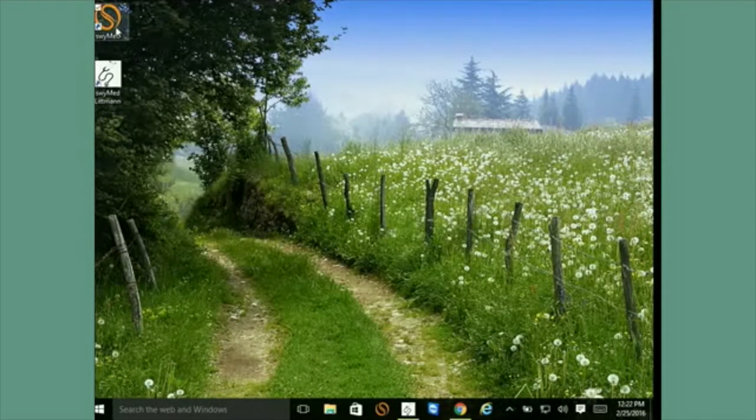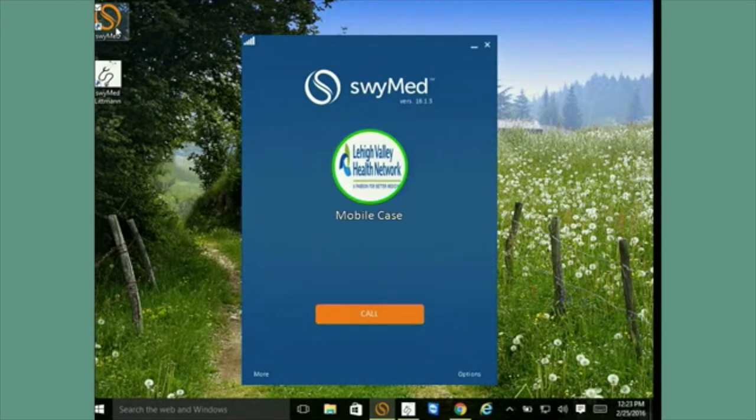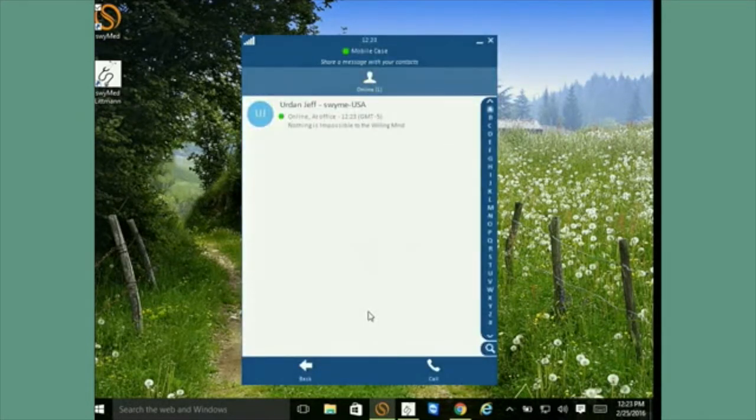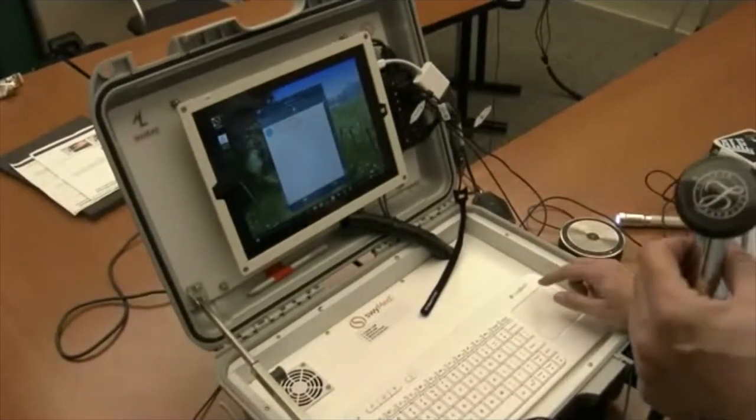The next step is to go to the SWIMED icon, double-click on it, and you will be connected to the server and ready to call. It will show the name 'mobile case' as your name. When you're ready to make the call, press the call button. You can operate using the keyboard trackpad or on the tablet itself. The tablet has been tested and works even with gloves on.